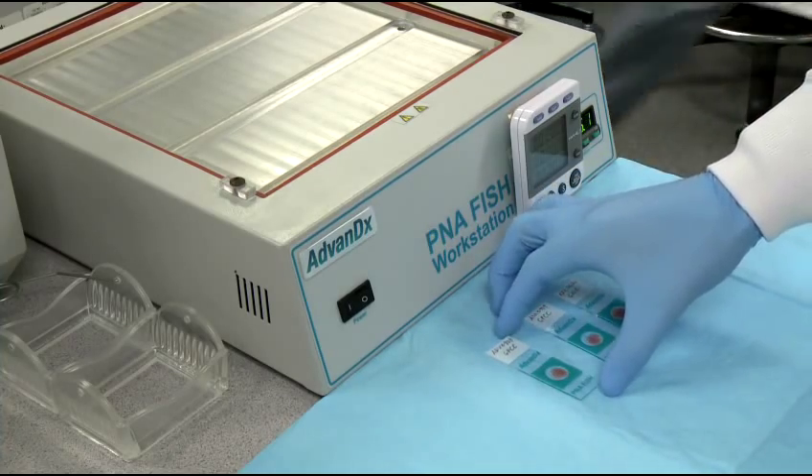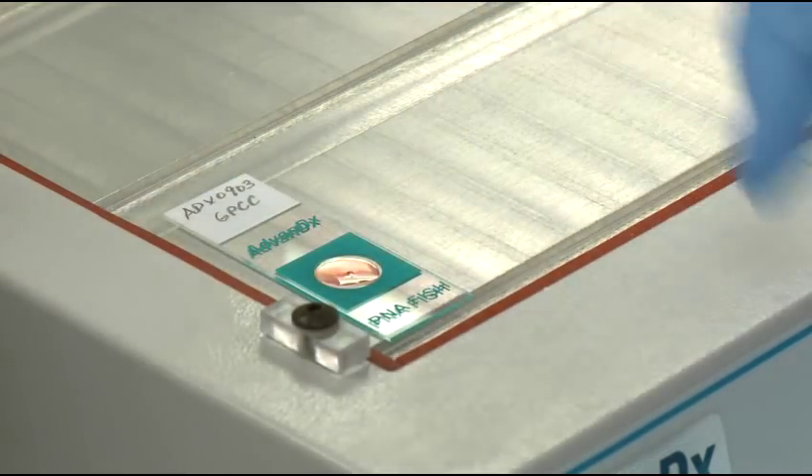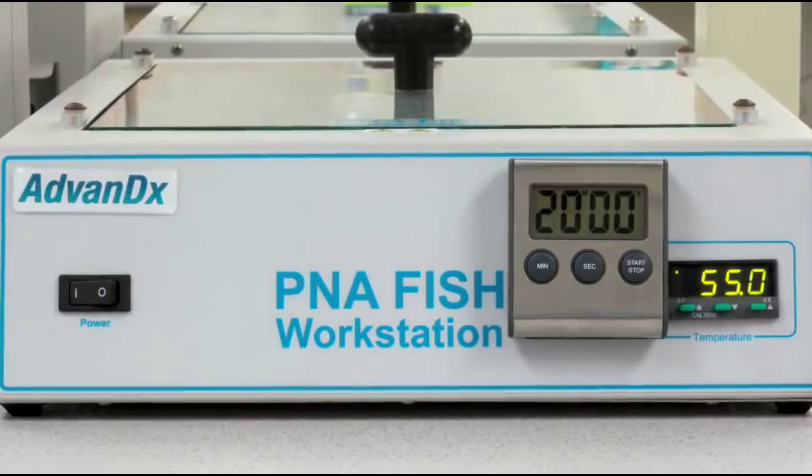Next, place the slides on the PNAFISH workstation and heat at 55 degrees for 20 minutes.